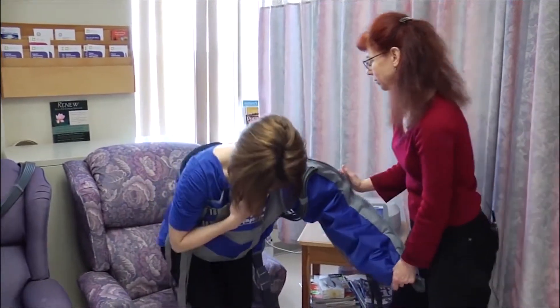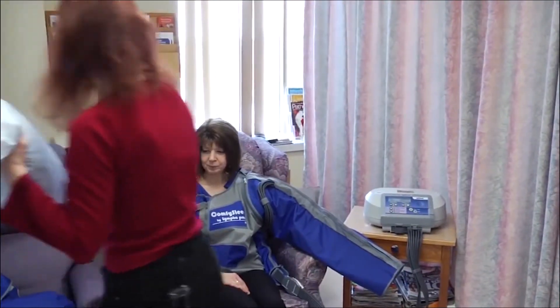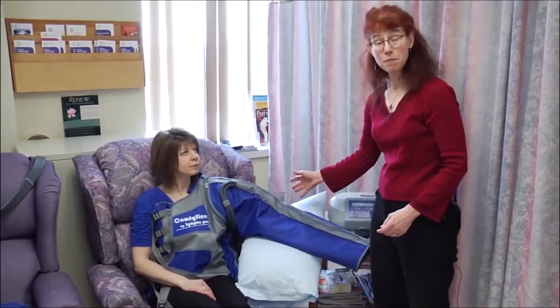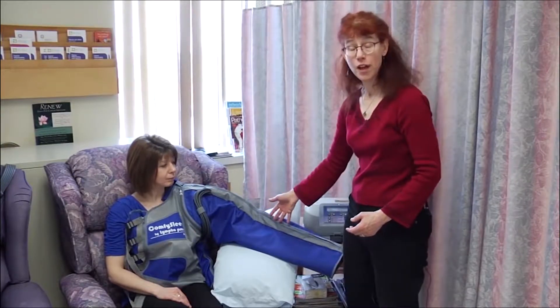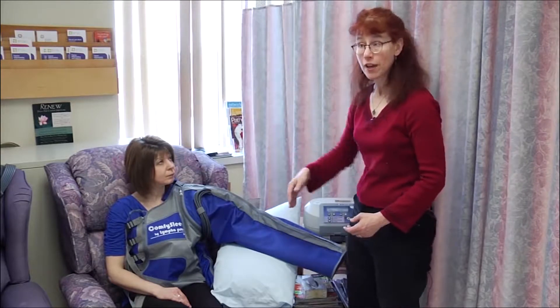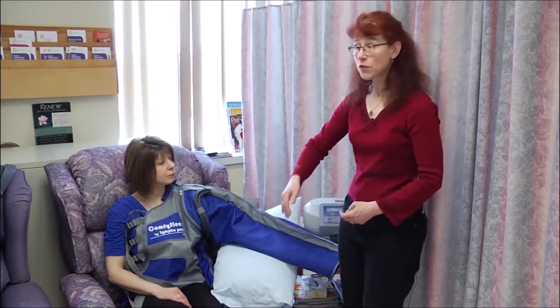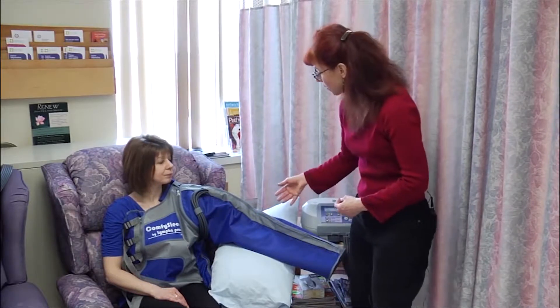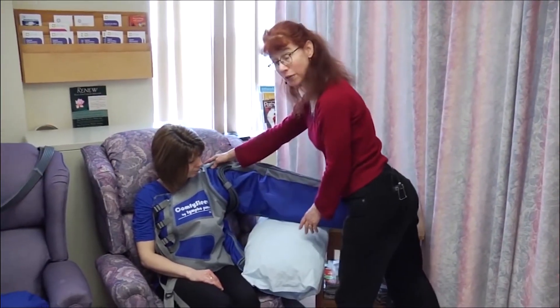Go ahead and sit down. I'm going to get a pillow to put under your arm. This treatment may be done sitting up or lying down — it doesn't really matter; it's about patient comfort, and arm position is about comfort as well. Some patients may perceive more compression with their arm in different positions, and patients who have stiffness or arthritis might choose to move their arm a few times throughout the session to shift body position so they don't feel stiff at the end of treatment. I also want to make sure the appliance is positioned correctly at her axilla.